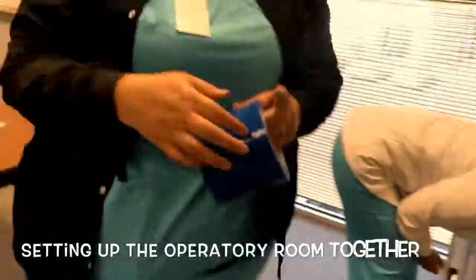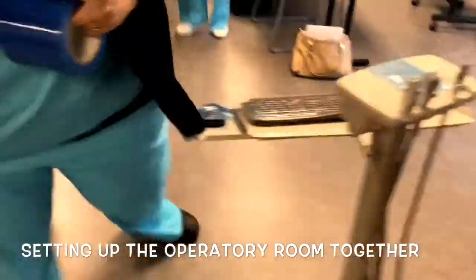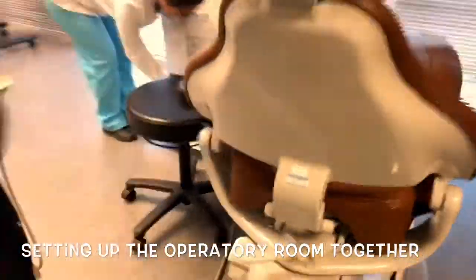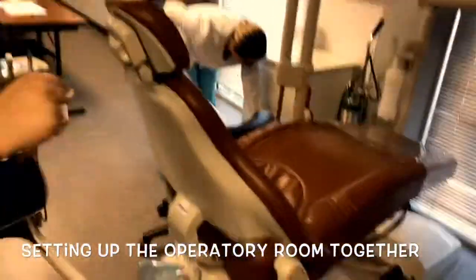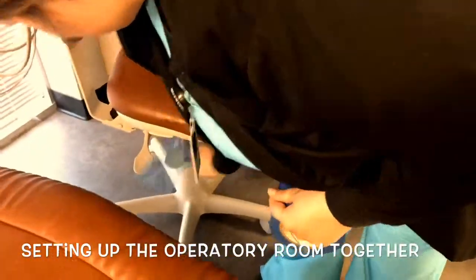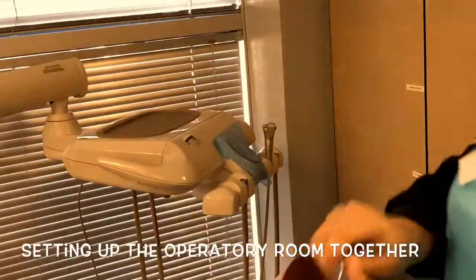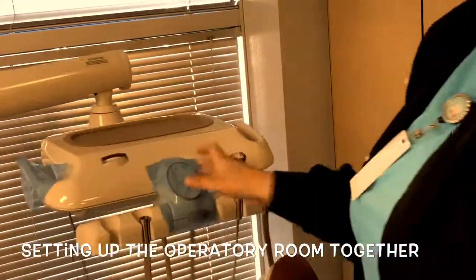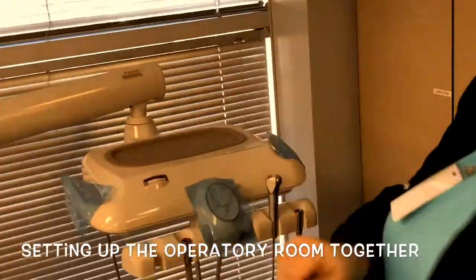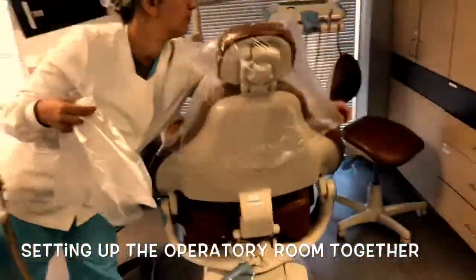And here we have Ali and Samantha setting up the operatory room with our blue tape, plastic bags, and plastic tubings. They're working as a team again to make sure that everything gets done effectively and quickly. Always remember to remove all the tape, plastic tubing, and plastic bags between patients. That's a part of disinfecting the operatory and getting everything ready for a new patient.